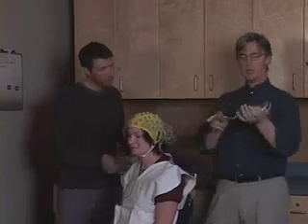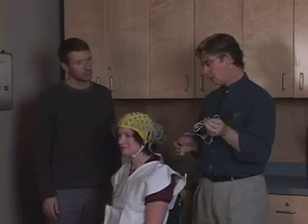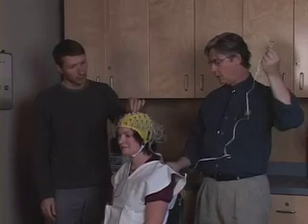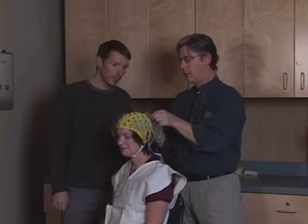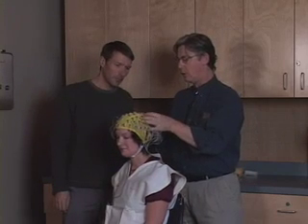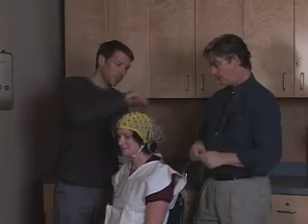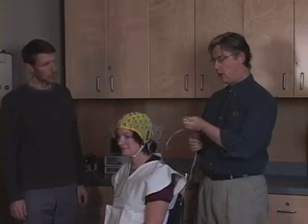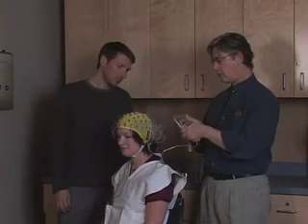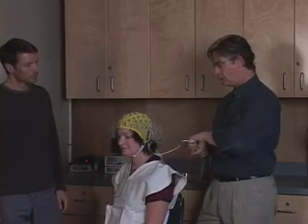These two electrodes here are the reference electrodes to which the other electrodes are calibrated to, so that we get even measurements from across the entire electrode array. They have to be placed in securely with a good connection, otherwise the system will not work. So if at some point there is a problem that we're not getting any readings from the system, the first thing to check are these two last electrodes.